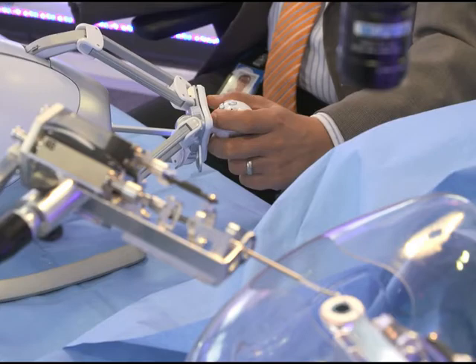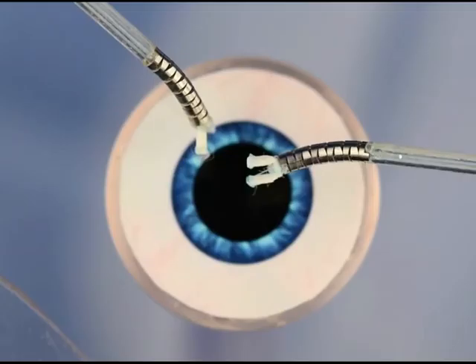What remains is the straight performance of the manipulation against the tissue. To make sure you have high performance, you want to make a manipulator that is as stiff as possible but flexible, and you also want as low friction a manipulator as possible to minimize losses and keep your actuators as small as possible. That's the other benefit of how we've designed the Axis system: it's a series of rolling metal links. From the standpoint of the tissue, it's all metal all the way up, meaning it's very stiff as opposed to using a more flexible material. But it's a series of rolling links as opposed to pin joints or sliding, in order to minimize friction and thus minimize any frictional losses which you'd have to overcome with your actuator.